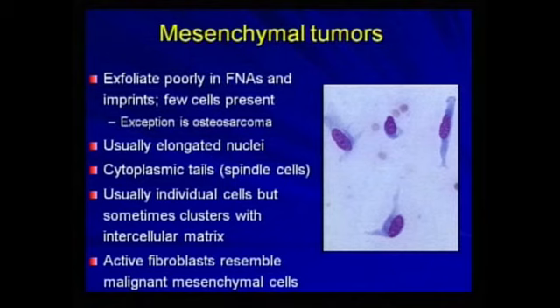We've looked at epithelial cell tumors, we've looked at round cell tumors. Let's look quickly at mesenchymal tumors. As we said before, mesenchymal tumors are spindle-shaped. They have tails, which are very important. And I teach my residents that tails on cells trump anything else. They're trying to figure out what it is. They tend to be individualized. They don't stick together. They do not have desmosomes.